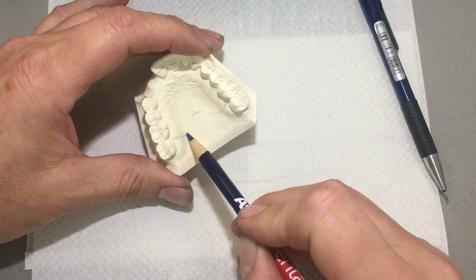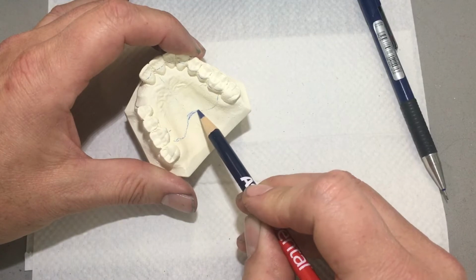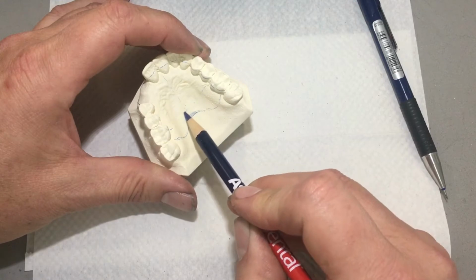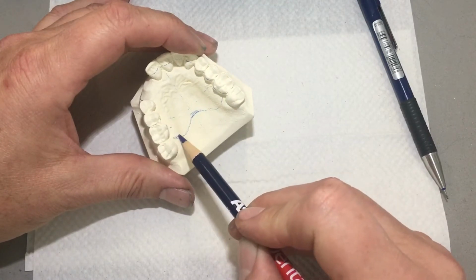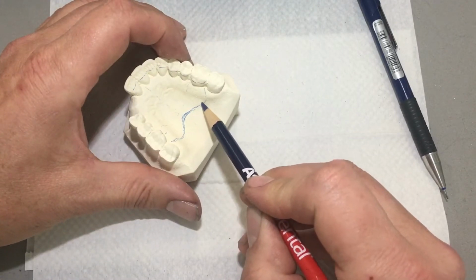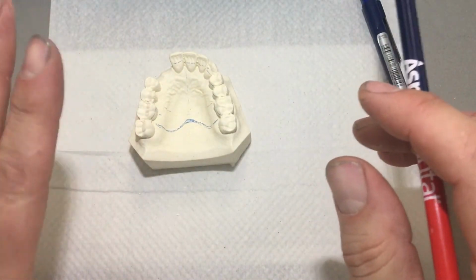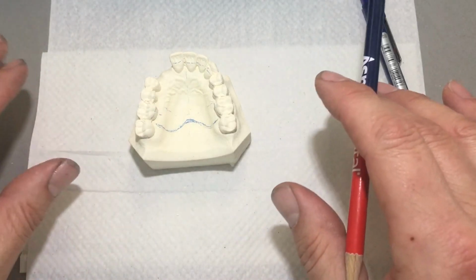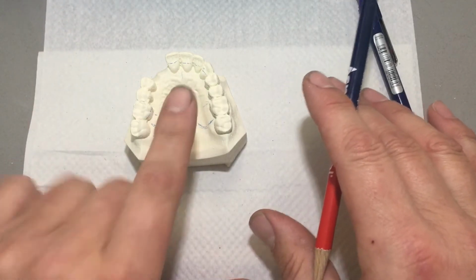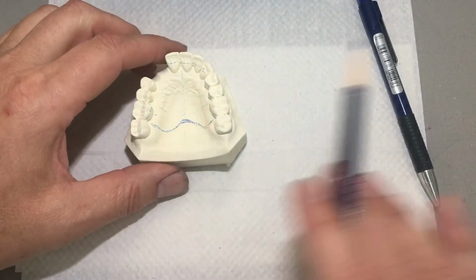And this anterior horseshoe acrylic partial shape should finish somewhere midpoint of the first molar, or at least anterior to the first molar. If I draw a line from the mesial of 6 to the other mesial of 6, it'll give you a rule of thumb of how far anterior this should go. But one thing for sure, which was unlike our first project, the acrylic major connector or the denture base should fit on the flattest part of the palate, meaning the flat part, not on an inclined plane where the patient can bite down and it slides down the palate. It's got to fit on the flat part.